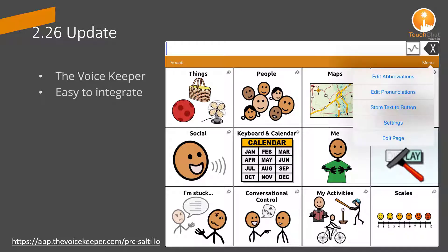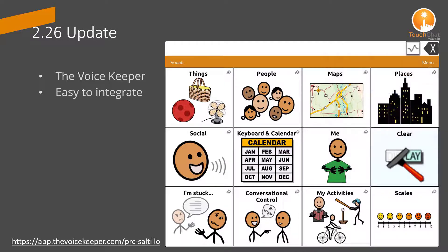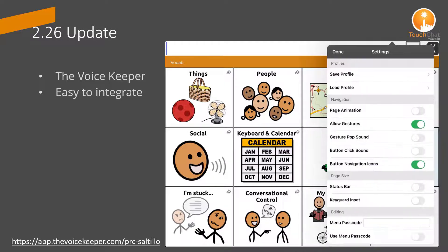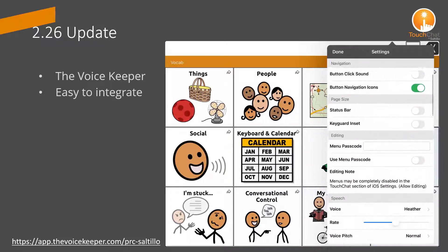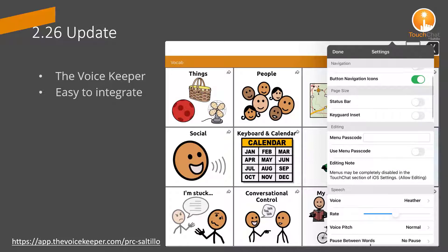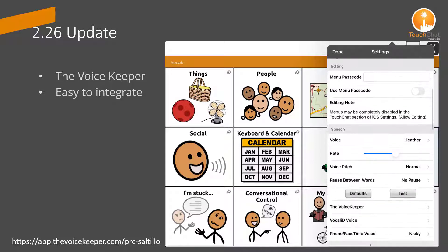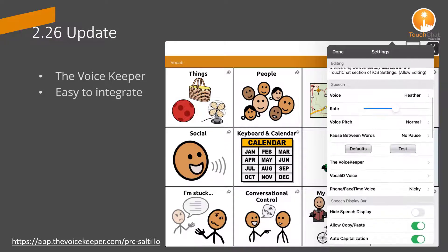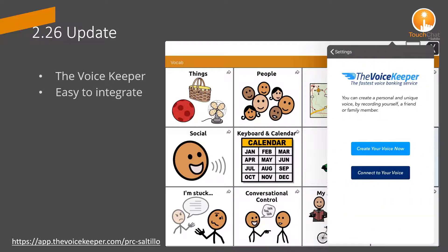I recorded 100 sentences to give it a try in a very short period of time. As I continue to record, the voice will improve. It was incredibly easy to add a custom voice to my TouchChat app.